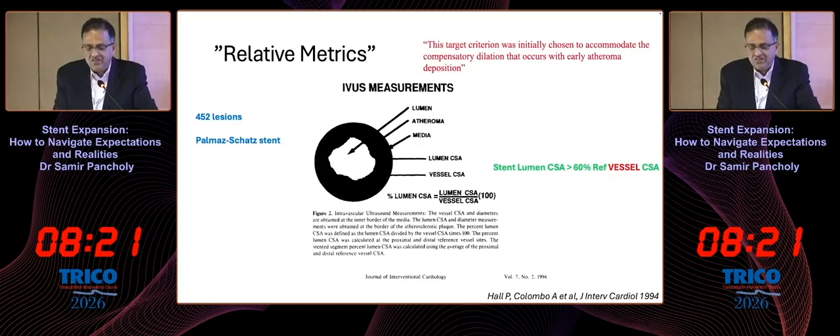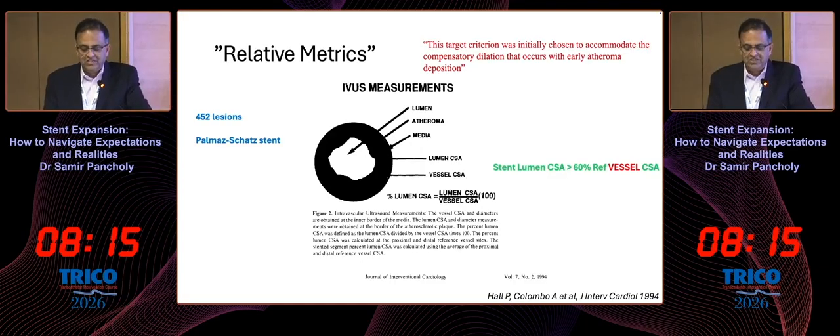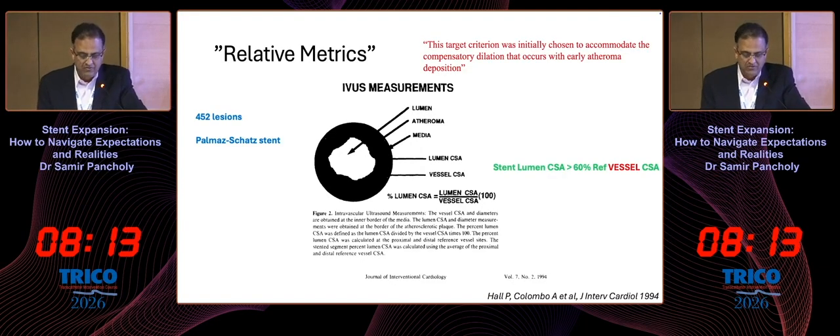He did this to assess for the compensatory dilatation of the vessel that occurs with atherosclerotic disease that we learned from Glagov. This all led to elimination of warfarin and using a dual antiplatelet regimen to get better long-term outcomes.